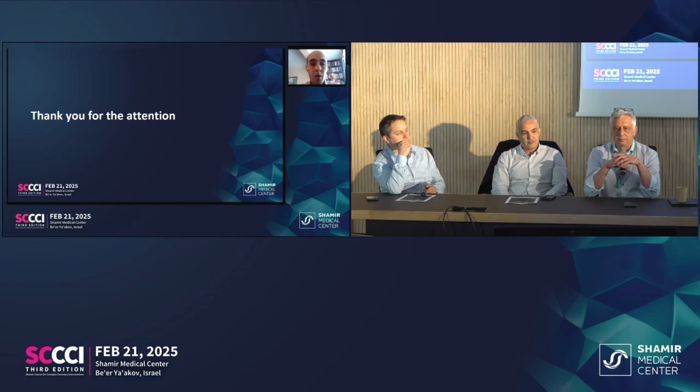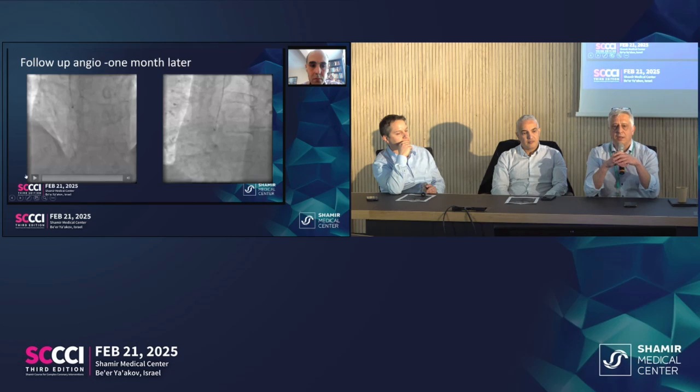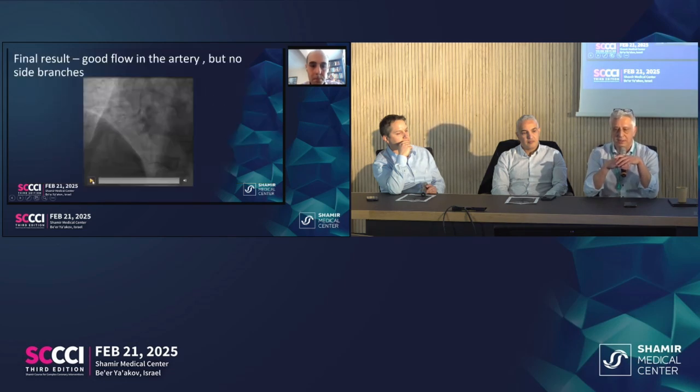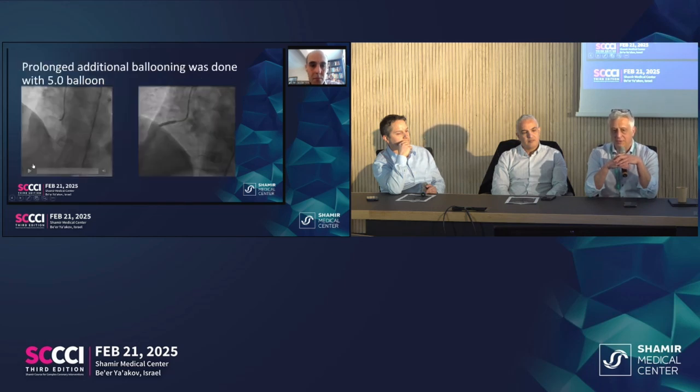I think that one of your runs of pictures after the event showed that there was some haziness and maybe tissue or thrombus inside the artery. And when you put a stent, leaving a huge hematoma outside the artery, you will deal with thrombus outside the stent, and it may propagate and partially compromise flow in the stented artery. Maybe this was the problem.